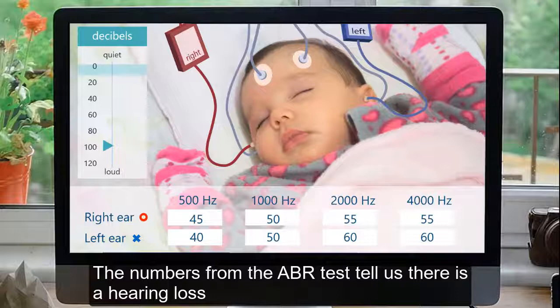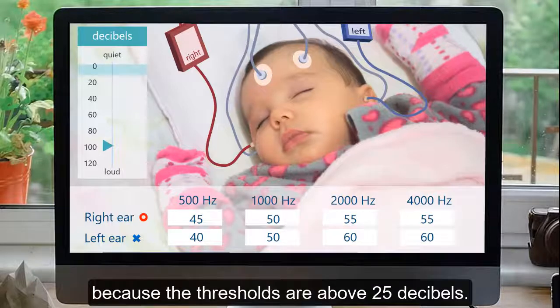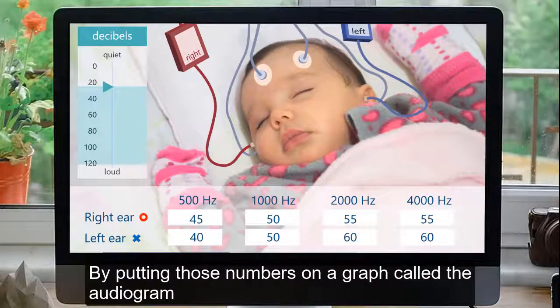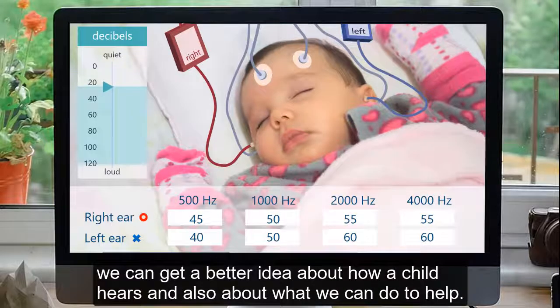The numbers from the ABR test tell us there is a hearing loss because the thresholds are above 25 decibels. But what do those numbers really mean? By putting those numbers on a graph called the audiogram, we can get a better idea about how a child hears and also about what we can do to help.